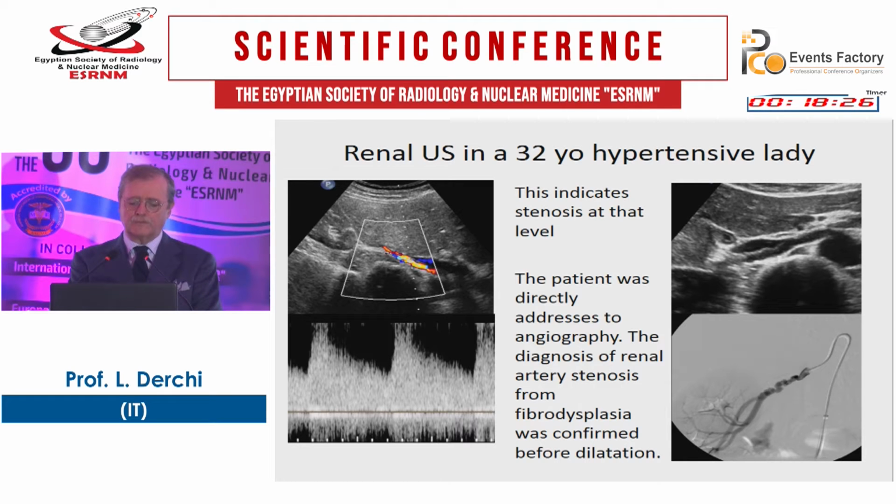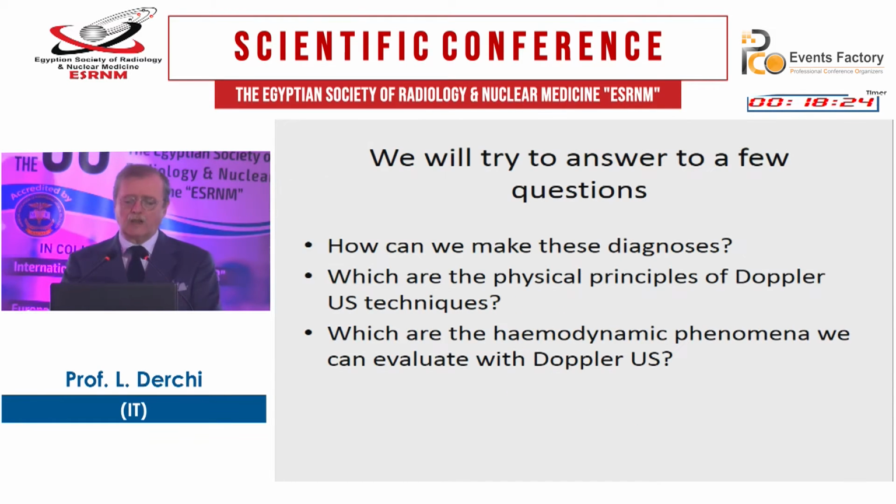So, how can we make these diagnoses and be sure about them? Which are the physical principles of Doppler ultrasound techniques, and which are the hemodynamic phenomena we can evaluate with Doppler ultrasound?